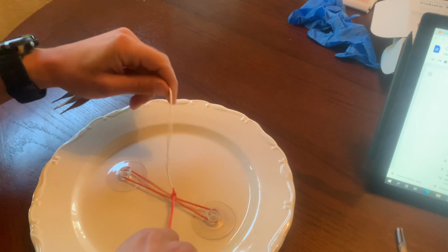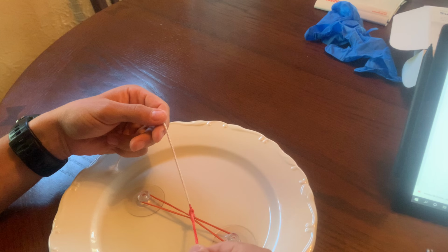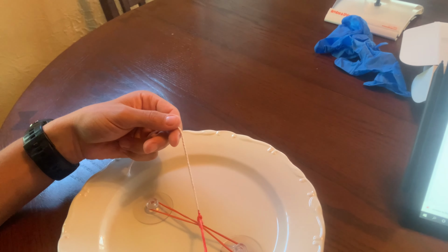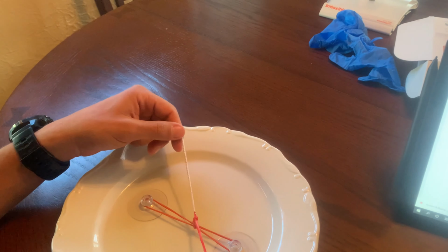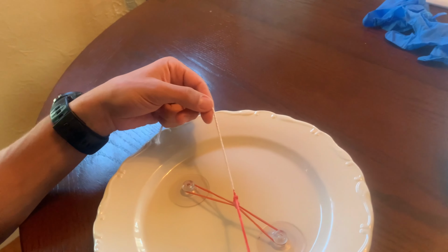Repeat this maneuver, alternating each knot and being sure to alternate sides with each throw. In general, the number of knots should match the gauge of the suture. Sometimes surgical knots can be upwards of 8 knots for one tie.